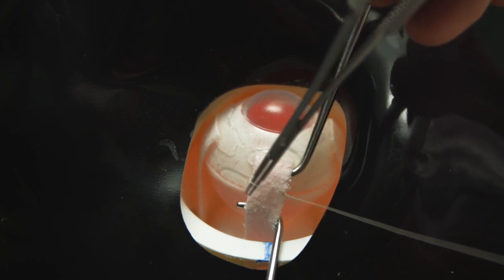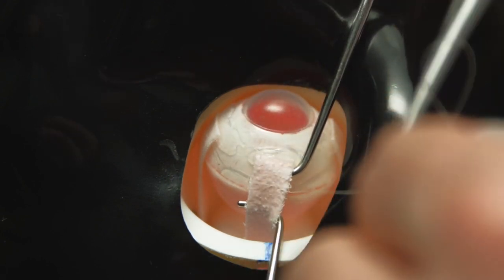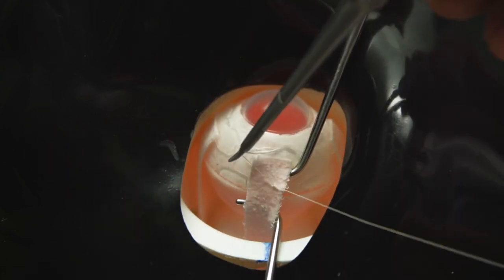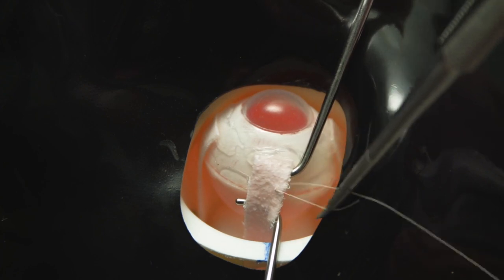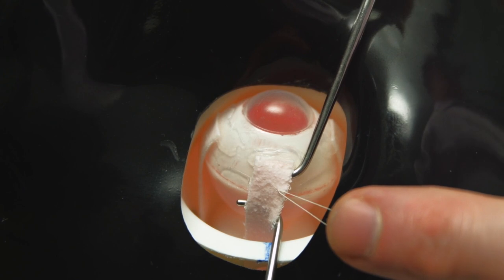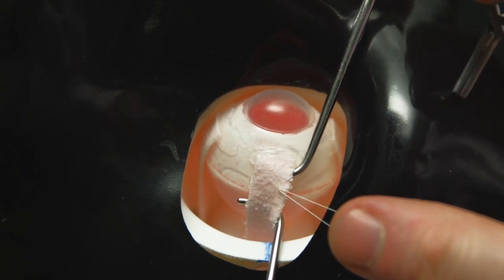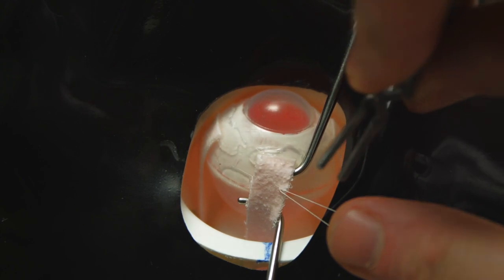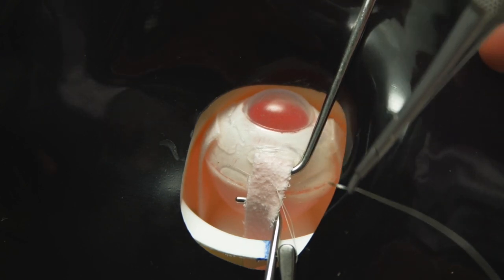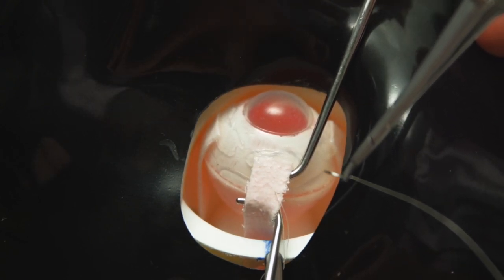Familiarity with the feel of the needle passing through the muscle and the opportunity to practice secure knot tying is essential for developing good surgical results in the future. The bulldog clip is just going to be placed here to secure the ends of this suture. The second suture is just being placed now.